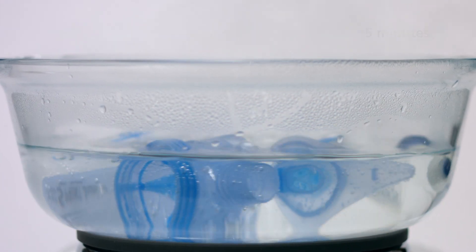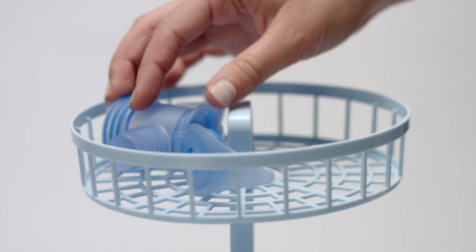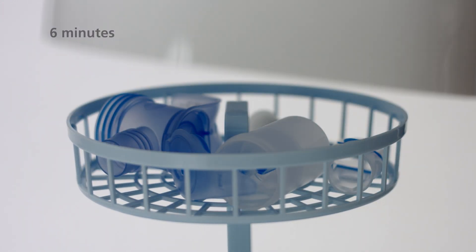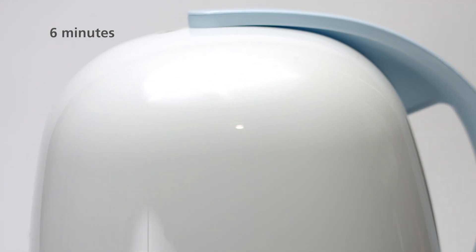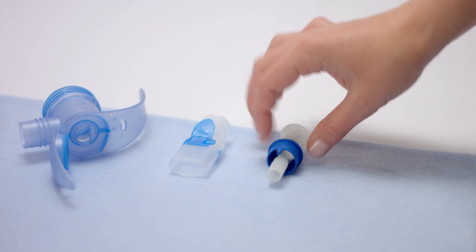Once a day, disinfect the nebulizer. To do so, either boil it for 5 minutes in water, or place it in a standard thermal disinfector for baby bottles for at least 6 minutes. Once dry, store all the parts of the nebulizer in a dry, dust-free place.